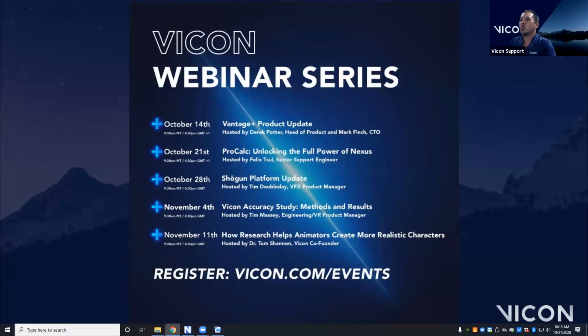And then we have, what additional resources are available for those who are new to using the system? So as I said, kind of there at the end, you do have obviously options for the YouTube, the docs.vicon.com, as well as please reach out to the support team at any time. We're always available. We're going to get back to you as soon as we can, and we're always happy to help with ProCalc questions, because as I said, it is pretty interesting, right? It extends your system and it goes beyond how do I just track these markers. It's like, what do I actually do with them?